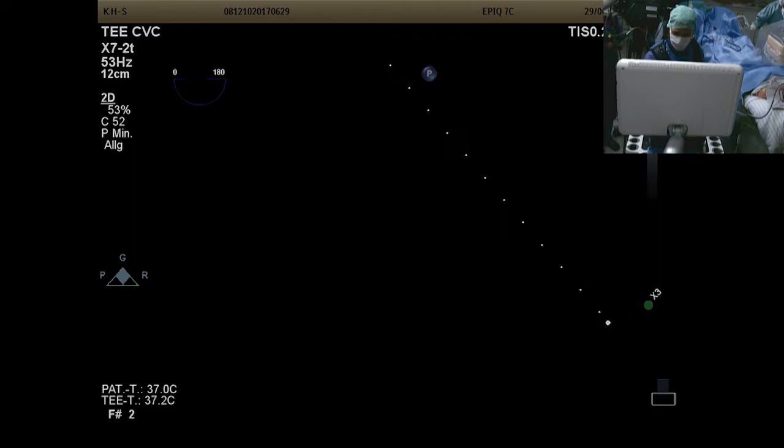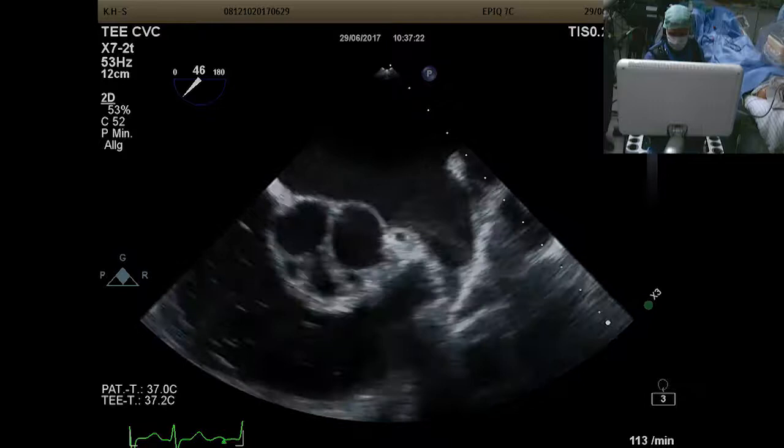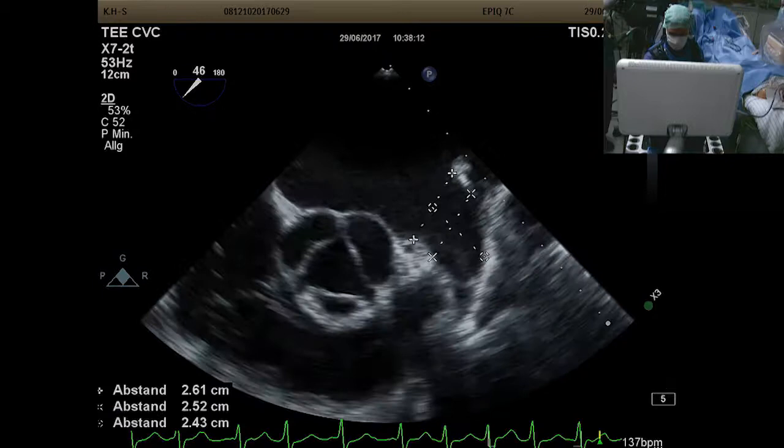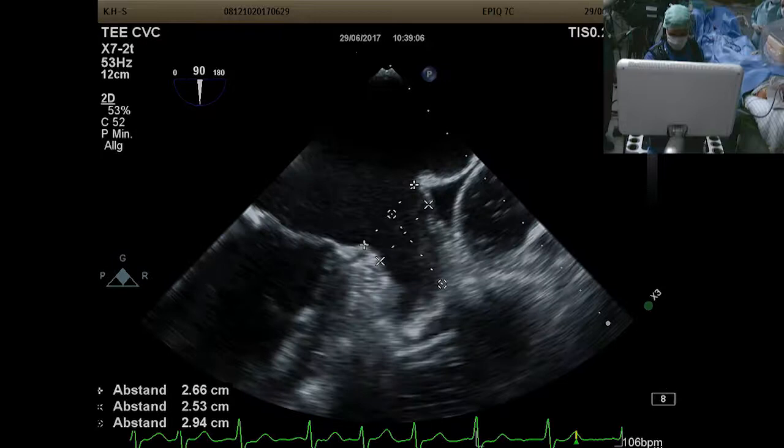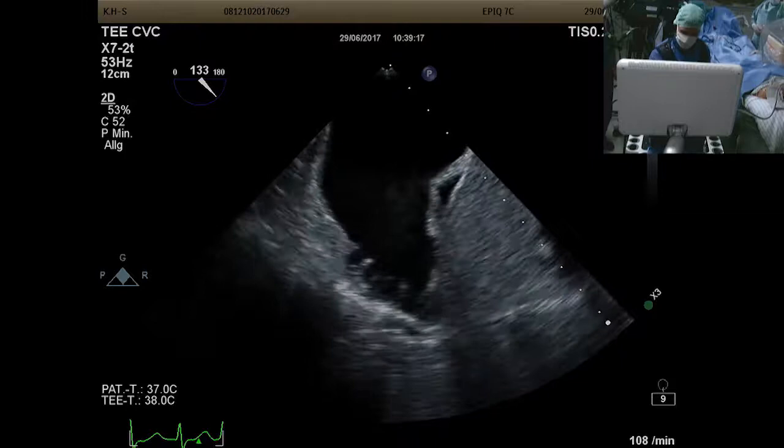Moving to 45 degrees, we can again see the spontaneous contrast. There's more than enough depth in this LA. The ostium here is 26, landing zone 25, and 24 is the depth of the LA. At 90 degrees we can see the same — no thrombus, but a lot of dense spontaneous contrast. The landing zone is around 25 here.